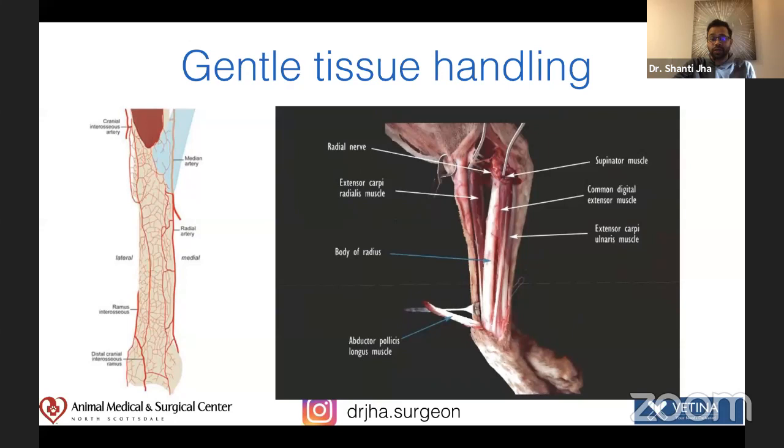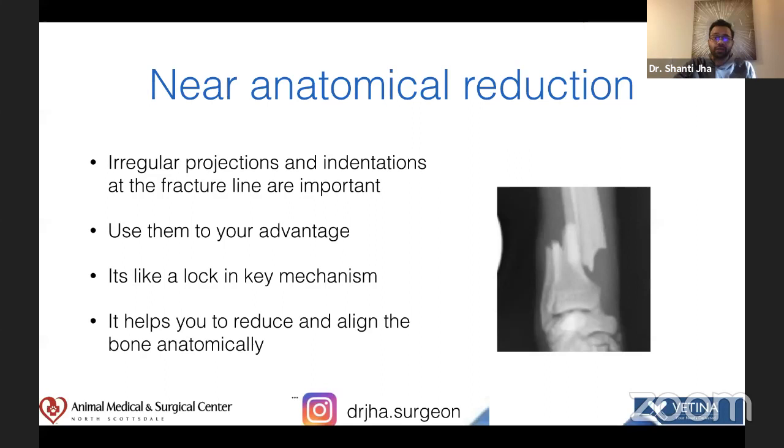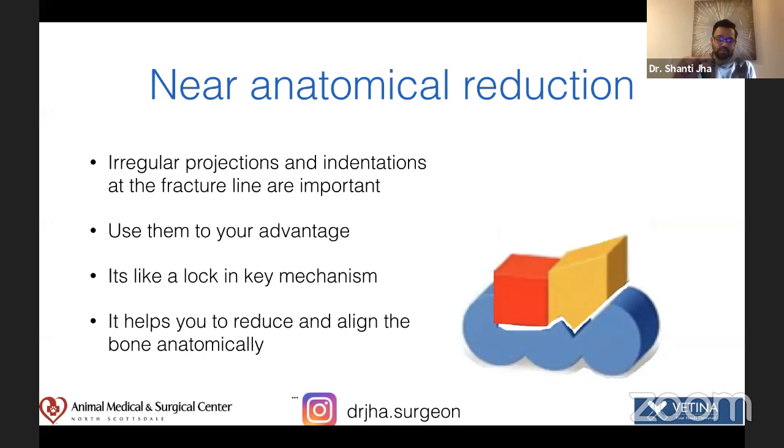Near anatomical reduction. So these are transverse or short oblique fractures when you see them; the first is probably lock and key. So once you find it, please compress it really well and then put the plate.